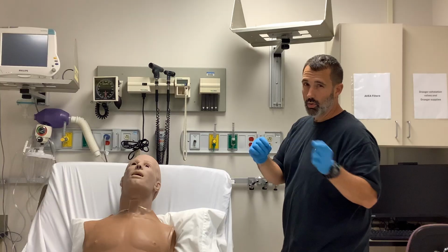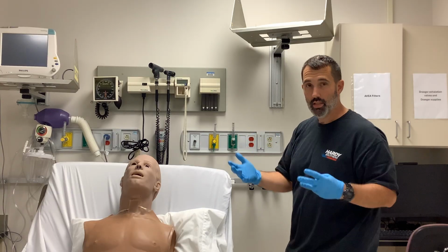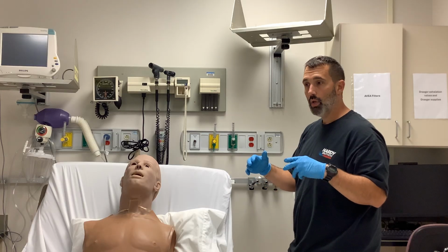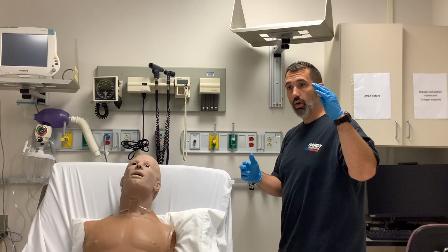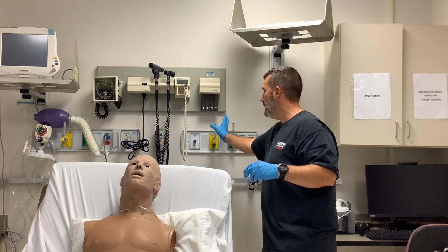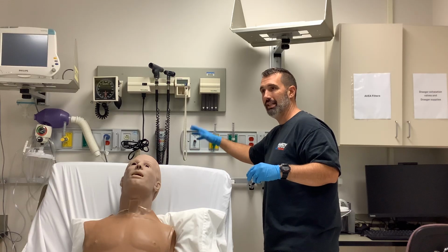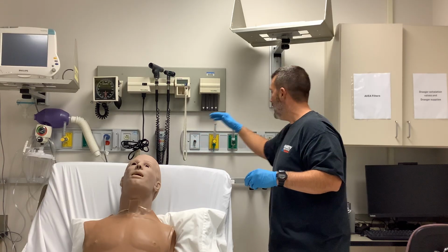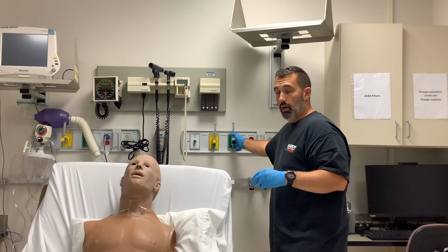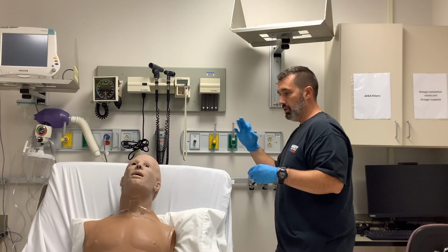You also, just a little trip down memory lane as we're getting into oxygen therapy, you'll remember about the different safety systems associated with oxygen delivery devices. So you've got the diameter index safety system, which is on display here. That means that an airflow meter is only going to attach to an air outlet. A vacuum regulator is only going to attach to a vacuum inlet. And an oxygen flow meter is only going to attach to an oxygen outlet because of the different diameters.